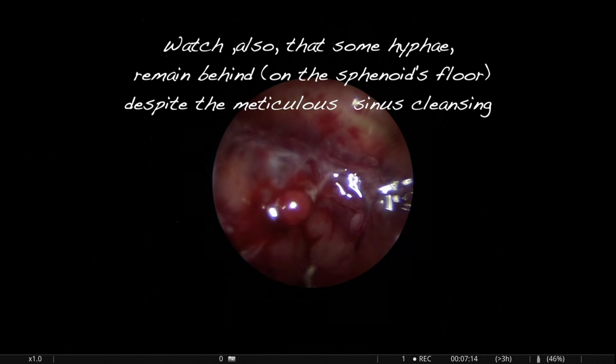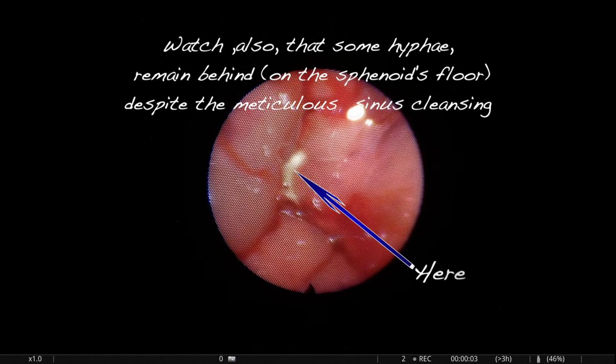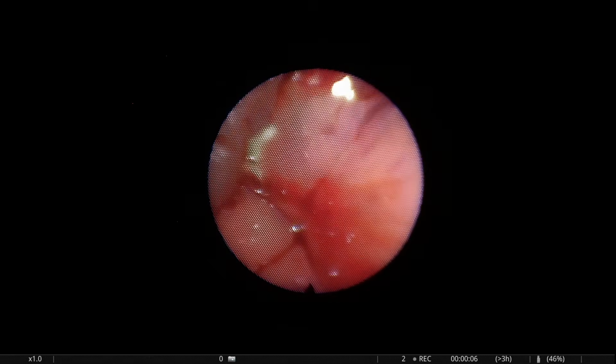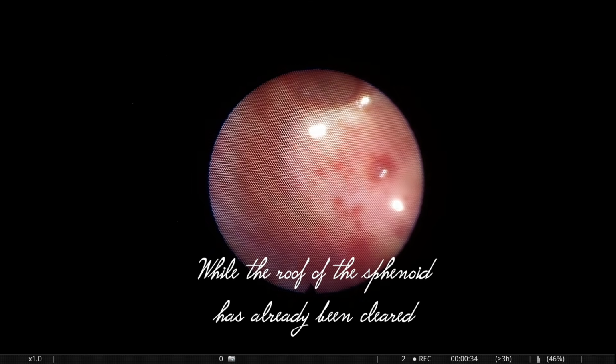Watch also that some hyphae remain behind on the sphenoid's floor despite the meticulous sinus cleansing. Here, while the roof of the sphenoid has already been cleared.